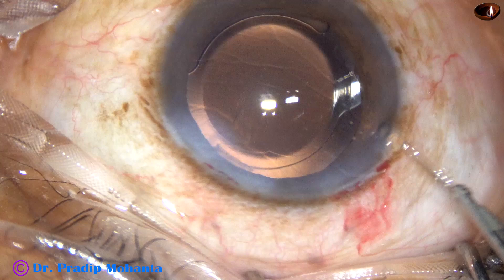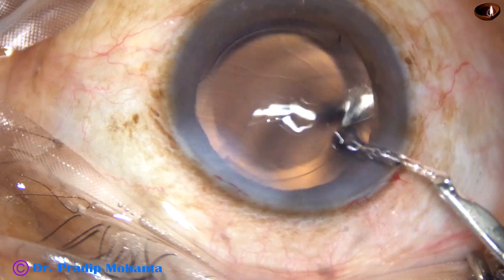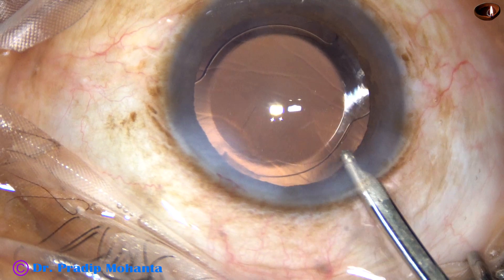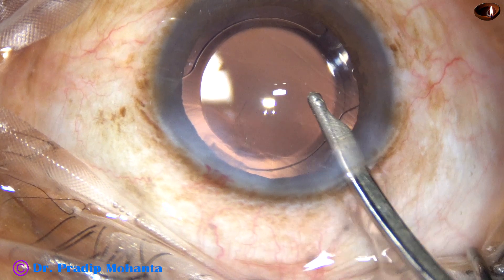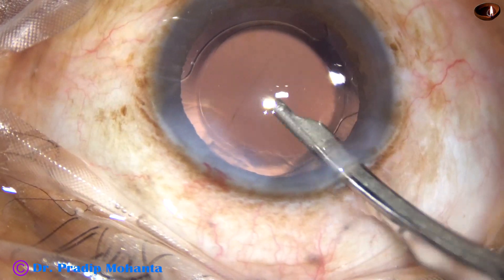With a Simcoe cannula, you have the benefit of double irrigation. You can take about 5 cc of fluid in the syringe and flush it out through the aspirating port toward the corneal endothelium very gently.